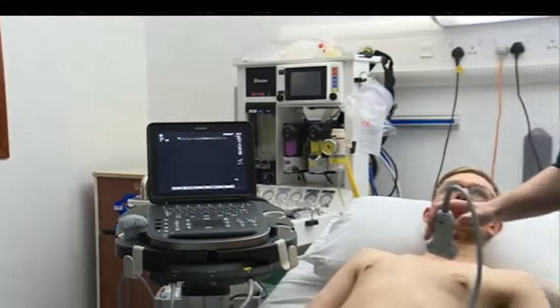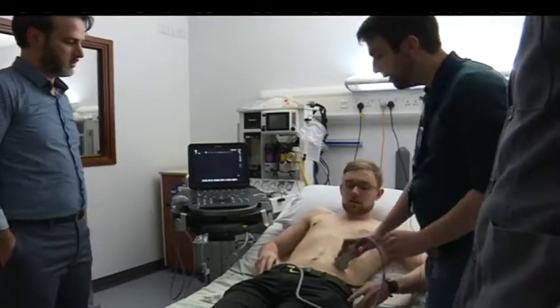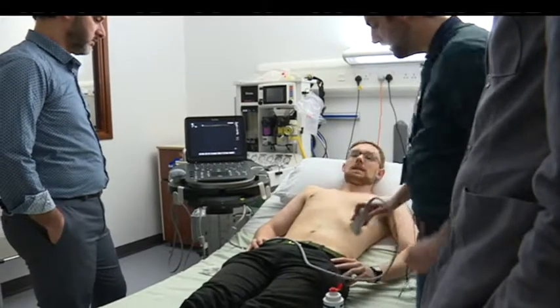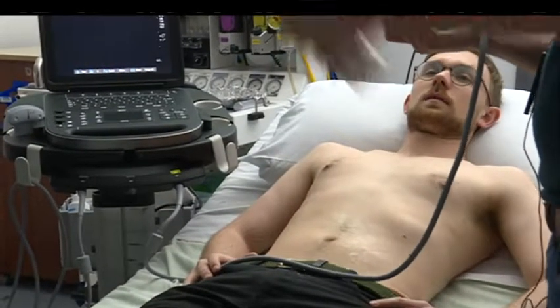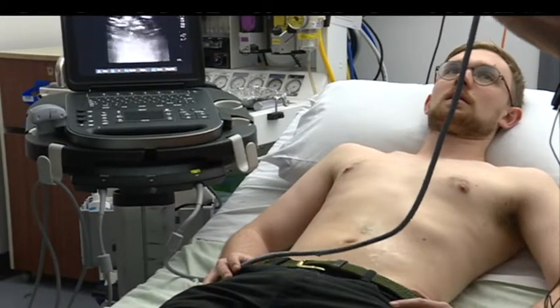Not going to do the TQL. The ilioinguinal block is basically a TAP block: anterior superior iliac spine towards the umbilicus, place the probe on in that plane, and you get those sweeping-looking muscles. The ilioinguinal is quite a nice block.